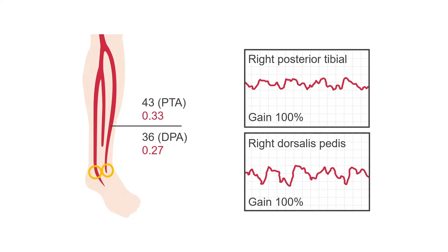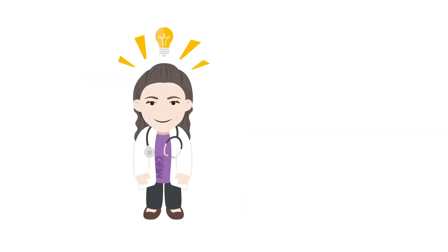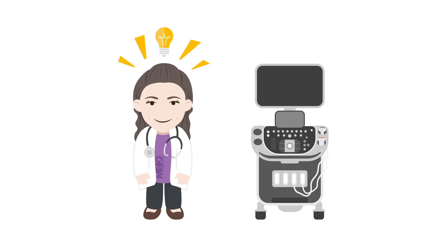Compare this patient's ABI test to the duplex. The damped monophasic ankle waveforms and abnormal indices suggest stenosis, but it doesn't give a location. The duplex confirms the blockage location is in the popliteal artery.